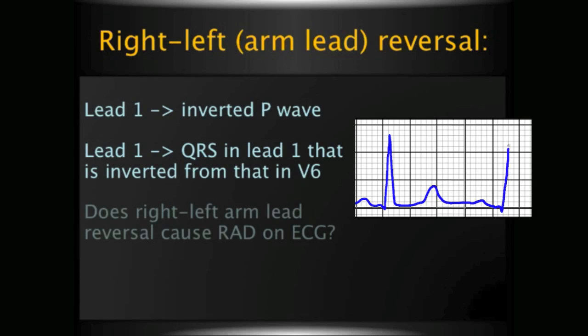And does right-left arm lead reversal cause right axis deviation on ECG? Yes, it does. Right-left arm lead reversal causes RAD.